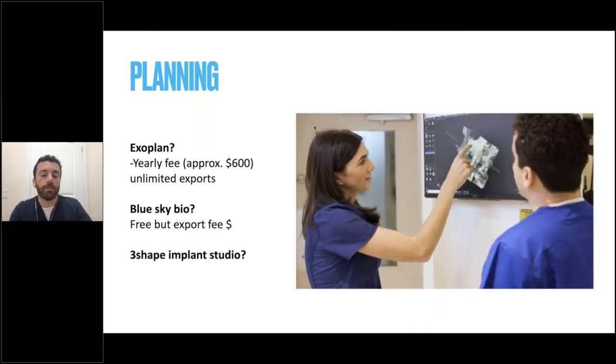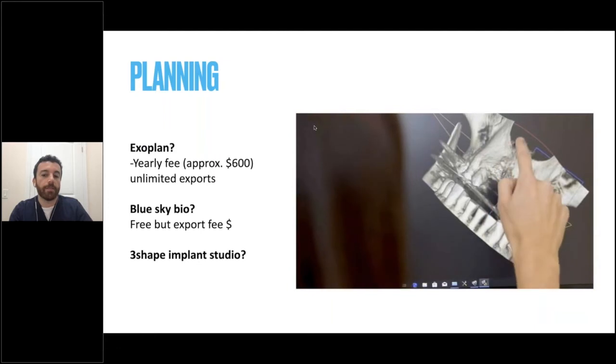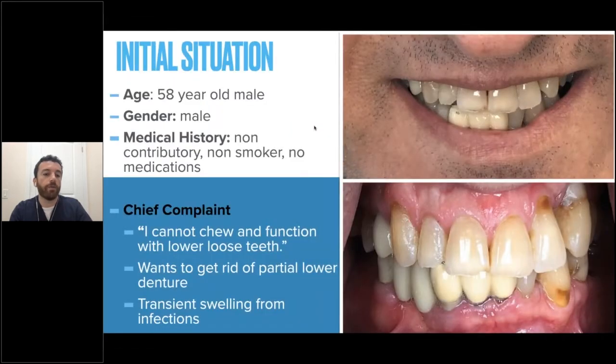I know Straumann has a great, basically modular approach in terms of providing these services, in which you can have the design done by them. And if you want to print the temporary or the prosthesis, you can do that yourself.